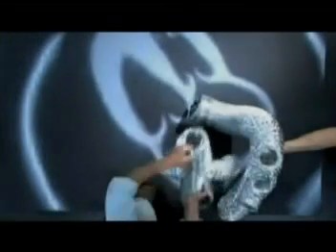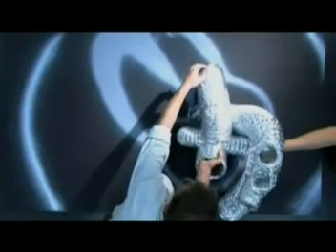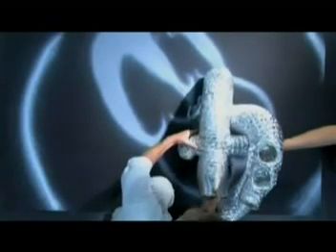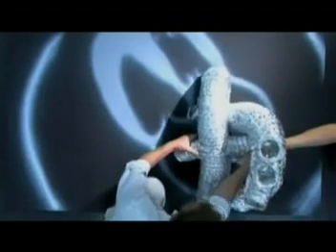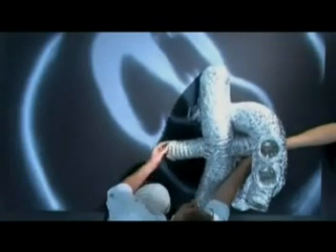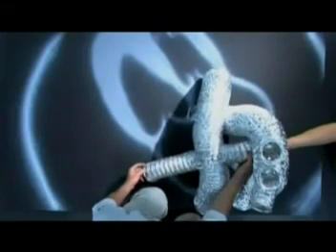The pulmonary outflow comes off the right ventricle and, as we demonstrated, runs more or less straight back towards the descending aorta down here. As it does so, it gives off the right branch of pulmonary round there, which curls its way round the ascending aorta, and the left branch of pulmonary comes off here into the left lung field.